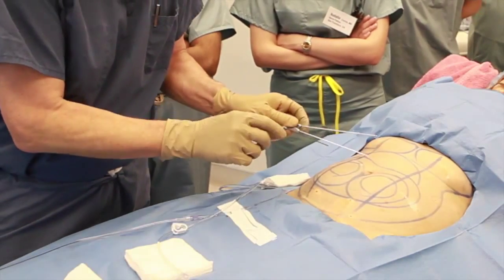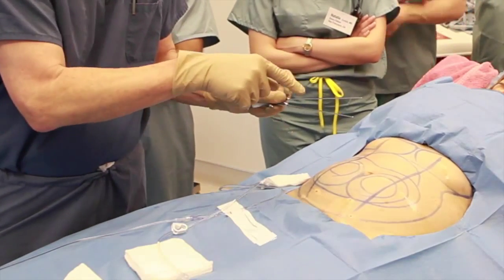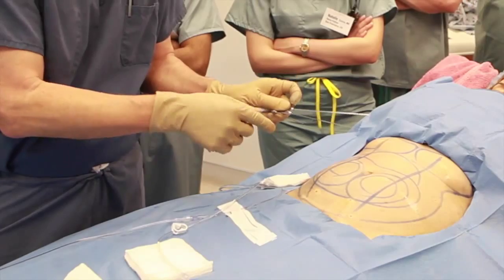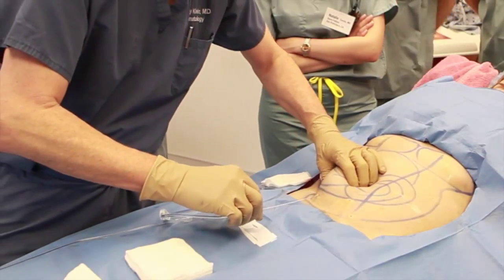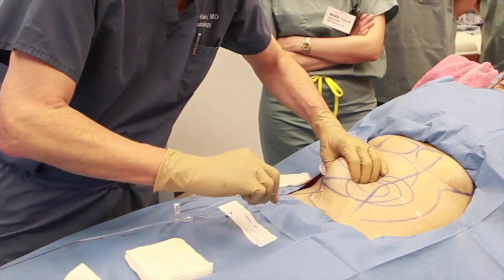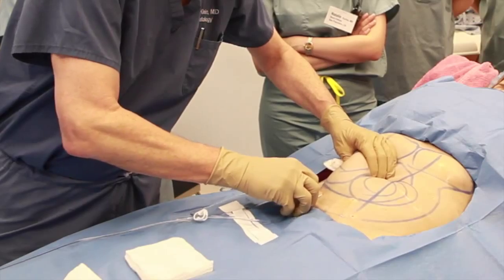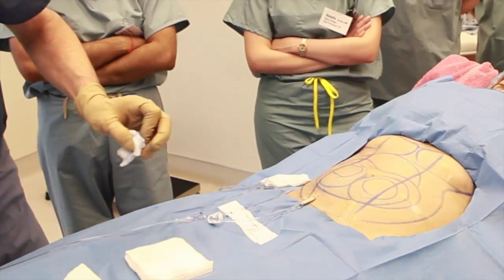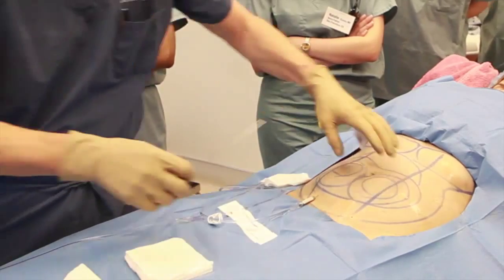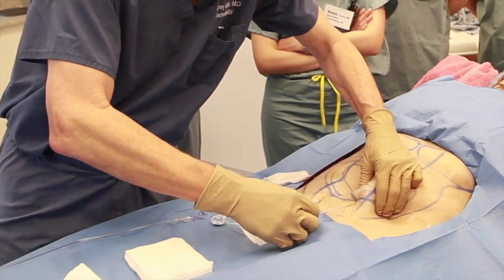This is a tip Monty with holes on the distal end, a half Monty halfway down, and a full Monty with holes virtually the whole length of the cannula. The full Monty has the advantage of delivering large volumes of tumescent lidocaine anesthesia in a fairly rapid fashion with very little local distention of tissue, because the holes are distributed along the entire length of the cannula. This makes for a painless infiltration.